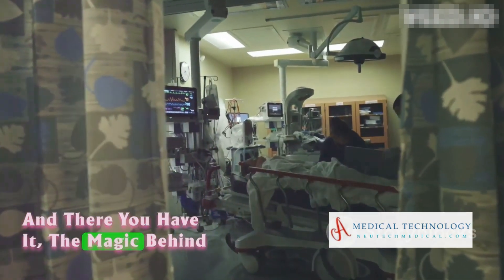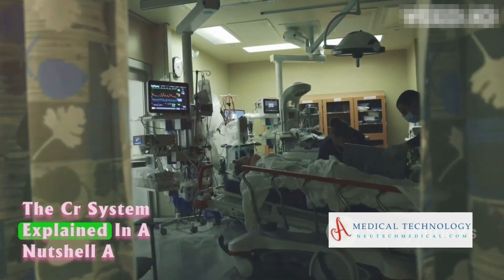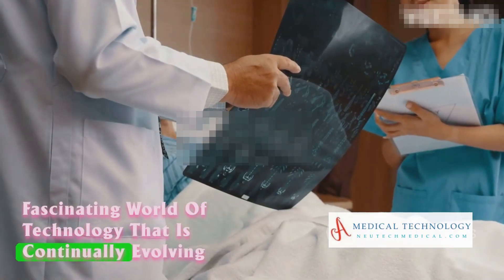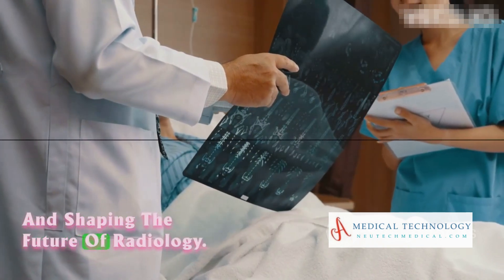And there you have it, the magic behind the CR system explained in a nutshell. A fascinating world of technology that is continually evolving and shaping the future of radiology.